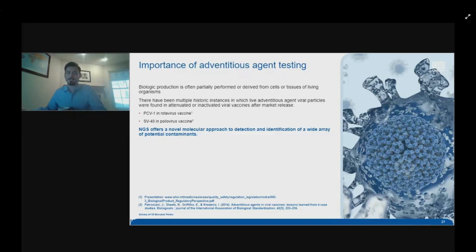And that is at least bulk level testing, the kind of thing that can be done with this panel for actual detection.